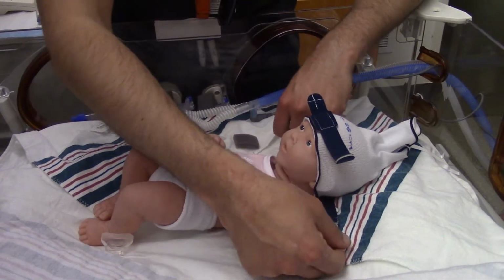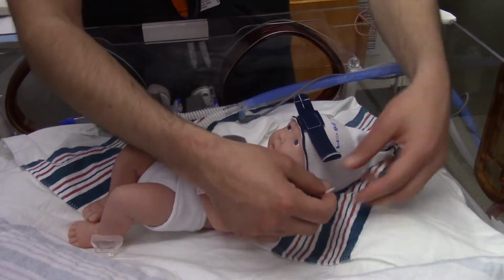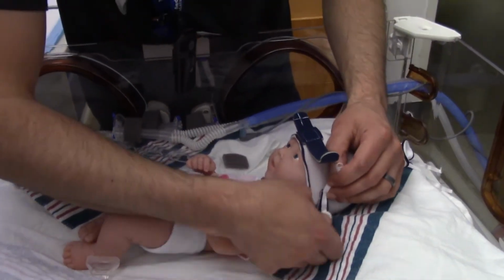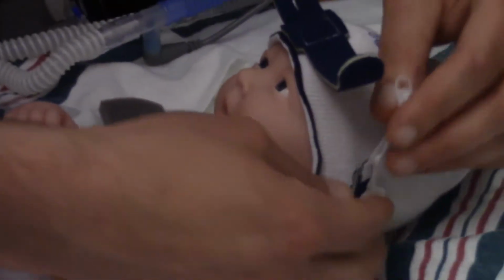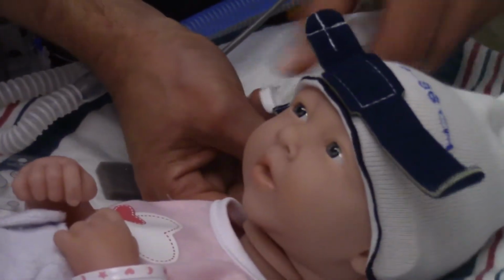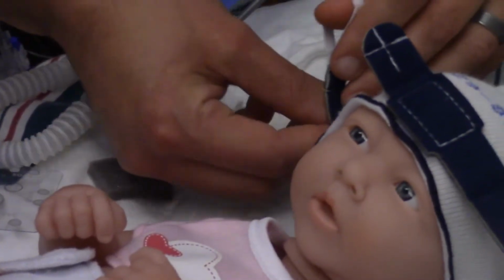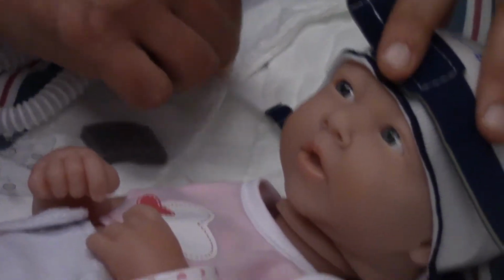Okay, the bonnet comes with two different sides. That's going to be our connecting side. Typically we want to start with our latch all the way over to give us the most room to play with. So there and there, and now we have total wiggle room.